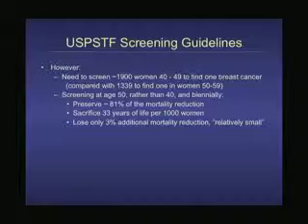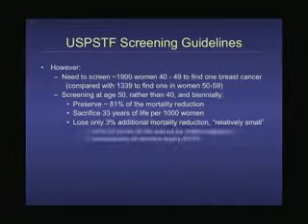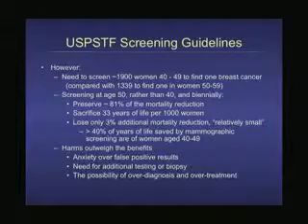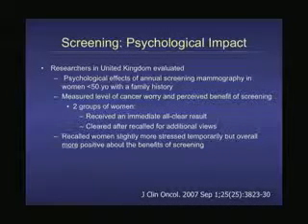You'd only lose 3% of the actual number of women that would die from this, but what they didn't consider is that that's 40% of the years of life saved, because these younger women have more years of life to live. They commented on the harms outweighing the benefits. They said there was anxiety over the false positive results, the need for additional testing and biopsy, the possibility of overdiagnosing and overtreatment. I guess they didn't read this study.